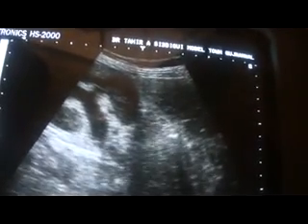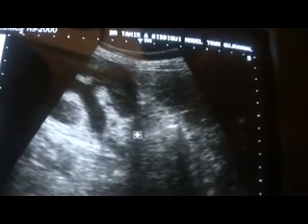On the left side, again you can see that these are seminal vesicles. You should not confuse them. My scanning angle is such that this is a transverse view and these are the seminal vesicles — they should not be confused with a dilated distal ureter in transverse section. This is the dilated distal ureter in transverse section, because as I move the probe 90 degrees, you see it becomes dilated. So both ureters are dilated.